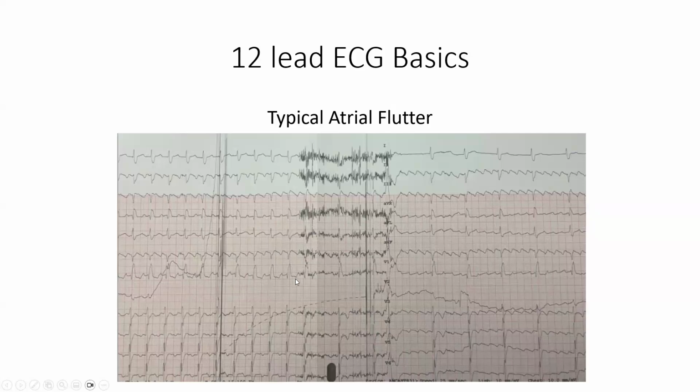For patients in rapid flutter who are unstable and or the rate is difficult to control, this could be cardioverted with a synchronized shock. Again, the risk is that if someone has been in this longer than 24 hours, there is potential for clot formation.